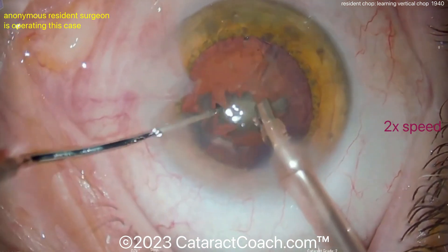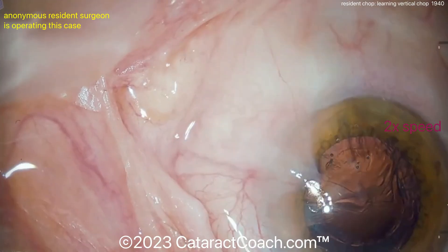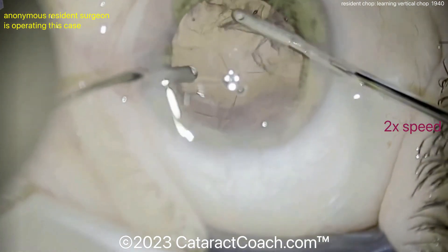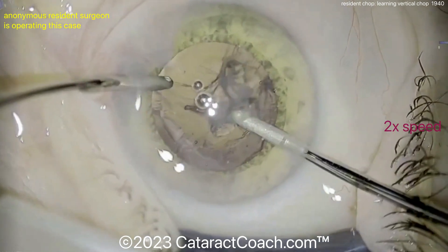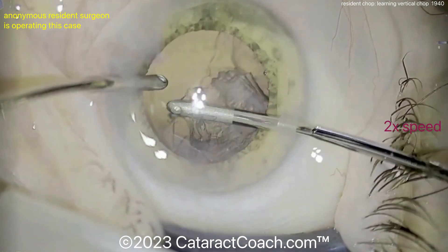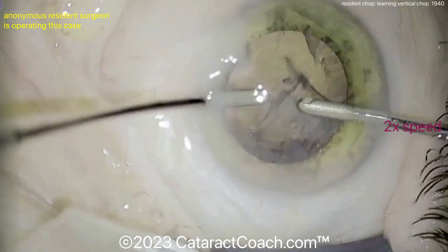There's the last piece coming up — nicely good control, good anterior chamber stability. Chamber stability is very nice and pieces are coming out, so definitely vertical chop is a good technique. The surgeon has now switched to a different lighting mode. With these digital microscope systems, you can change the lighting to help highlight the cortex — an interesting feature. The master of that is Luke Khan Mishahev, who has an amazing video setup and has really mastered the art of light filters for both anterior segment and retina surgery.